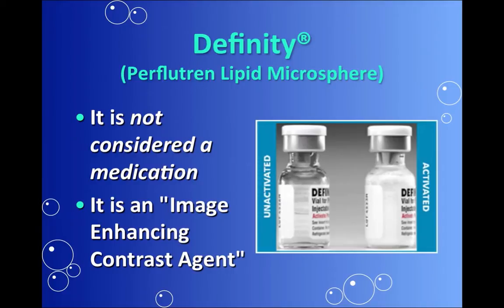The one on the left is clear, and this is what it looks like when it's first pulled out of the refrigerator. The vial on the right looks like propofol, and this is what it looks like after it's been activated. So use caution because this is a look-alike drug error potential. We'll explain what being activated means in a minute.